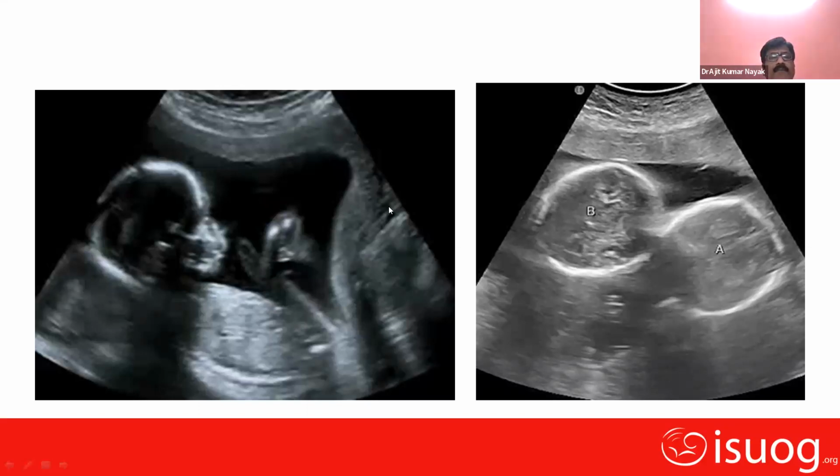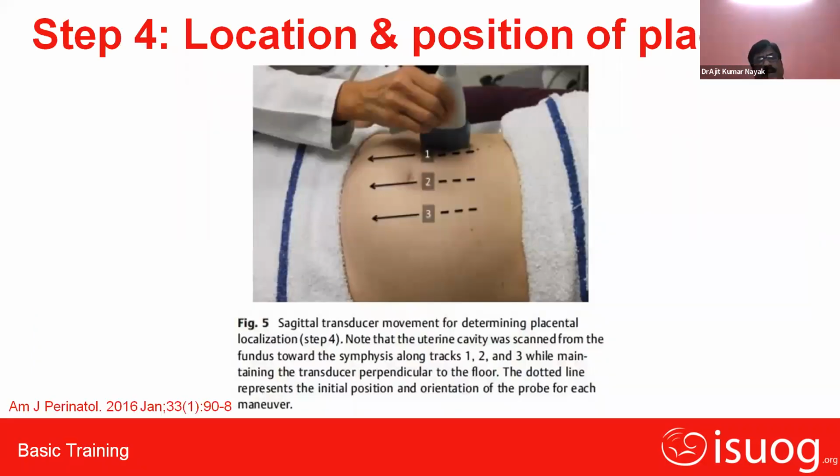Now comes step 4. So step 4 is about the placental localization. Here, the transducer is placed sagittally. The movement is very important to locate the placenta. This is the uterine cavity scan from the fundus. So all these steps were from the symphysis to fundus, but while localizing the placenta, this transducer has to be moved from the fundus to the symphysis pubis.